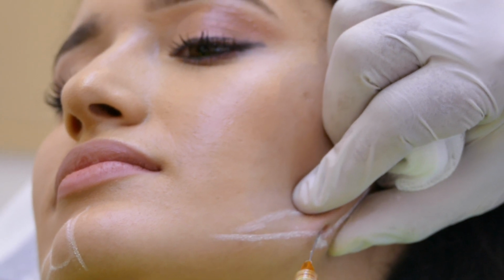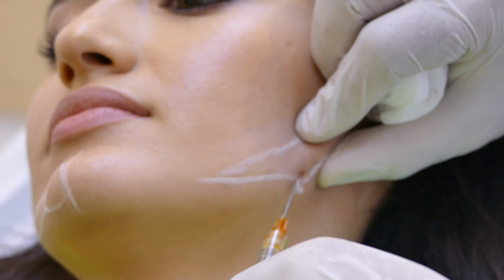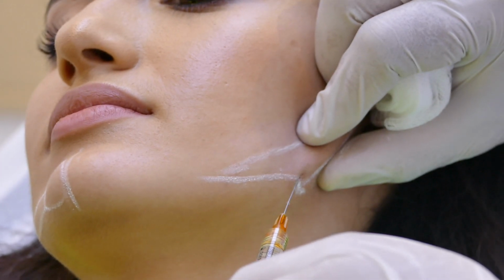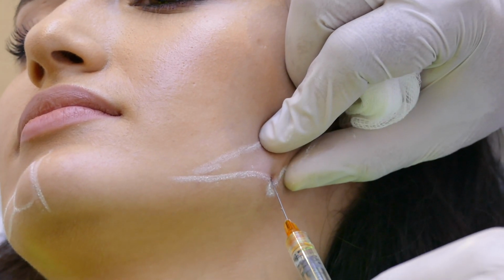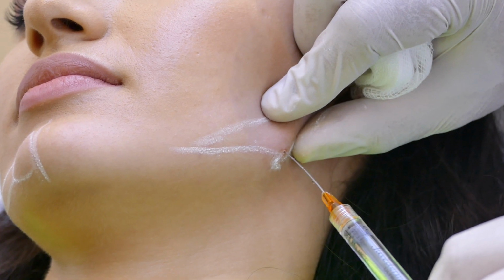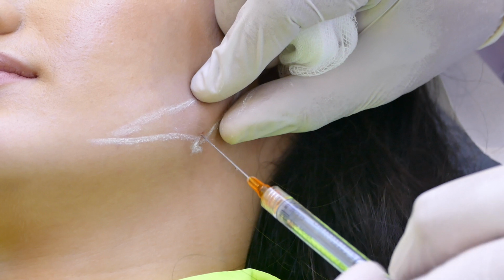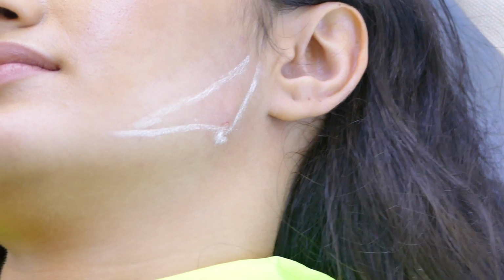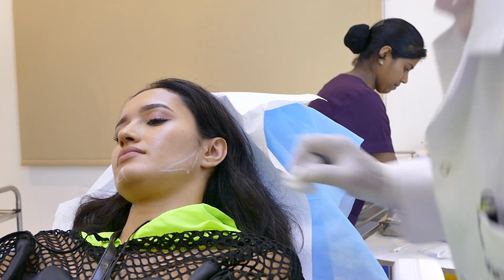The key is to inject at the lower border of the angle of the mandible, that will improve the vertical height. So I use about a good 0.5 to 0.8 ml of filler in this area to improve the vertical ramus of the mandible. This is a pretty safe zone, but if you inject deep, you will lose volume without visible enhancement.